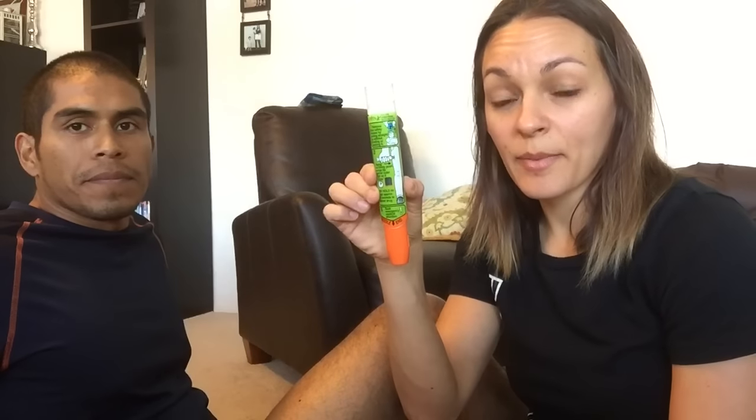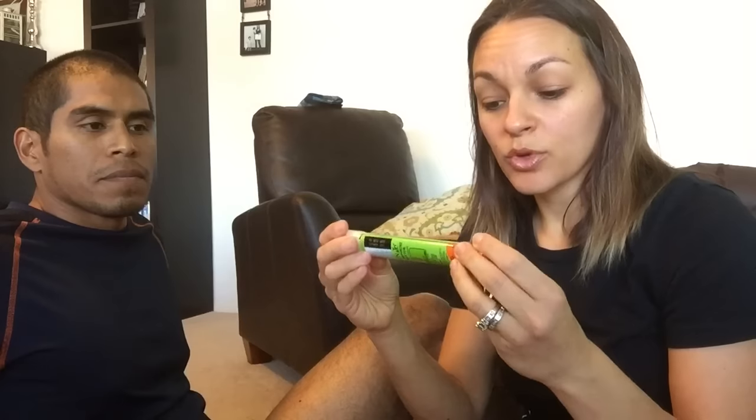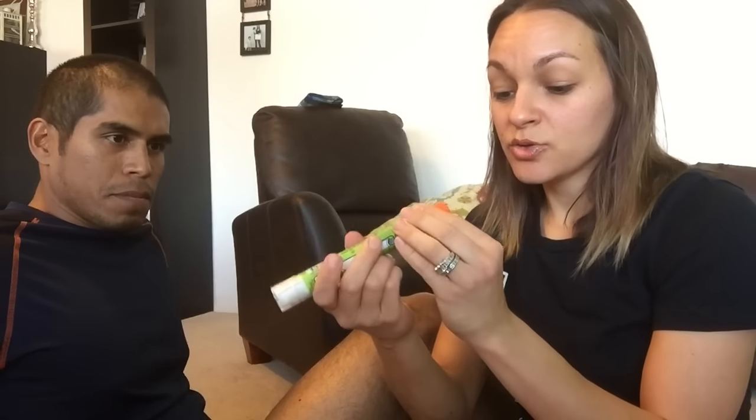This is what the EpiPen looks like after use. You can see the top is off. You cannot push this back down because it clicked out, which makes it different from the practice one. When you push the practice one till it clicks, it comes out and you can push it back in. You cannot do that with the actual EpiPen — but you just know that it worked, that it went in, because it locks out and you can see a tiny little bit of blood.